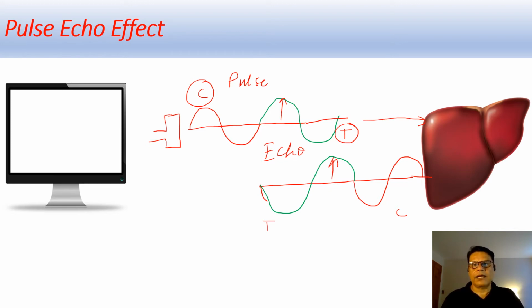But they carry a lot of information when they return from soft tissue, and this information is received by the transducer.